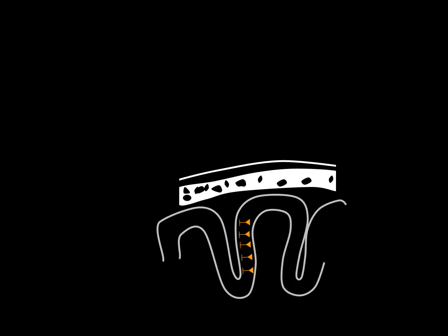Pyramidal cells in the wall of a gyrus, when activated, produce a horizontal dipole. That is, many horizontal dipoles. Horizontal dipoles, looked at from straight up by an electrode matched with a neutral reference, will view a negative solid angle and a positive solid angle. The negative solid angle will be viewed at the point where the dipole is negative, and the positive solid angle will be seen where the dipole is positive. Here they are represented, the negative by the yellow omega and the positive by the aqua omega.